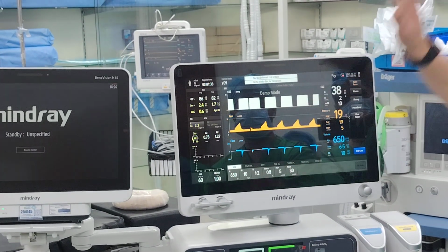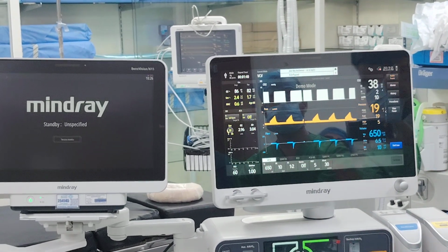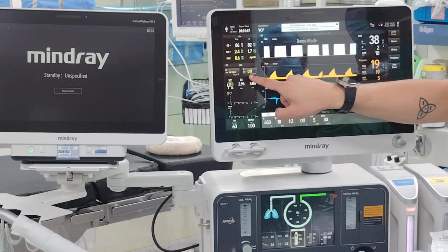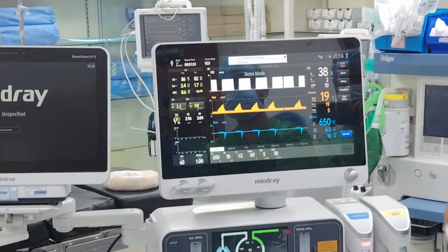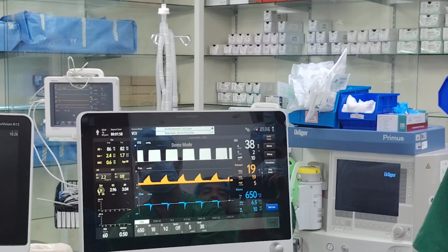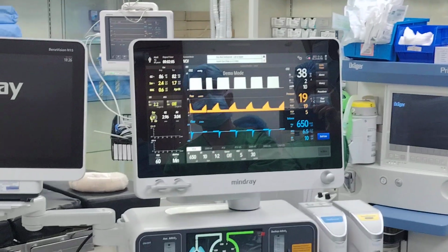Confirm, confirm, khalas. What happens right now? Forget about this. This is a warning because it's high. And then the machine will go as fast as possible to hit this target. Once it's reached, later on, keep your eyes here. This one you will see later on slowly go down to 0.3. Okay? And I will repeat. If I don't want 0.3, I want 0.5, click here, 0.5. If I want 0.3, which is the lowest, you can click here, you press minimum, it already is 0.3. Is it clear?